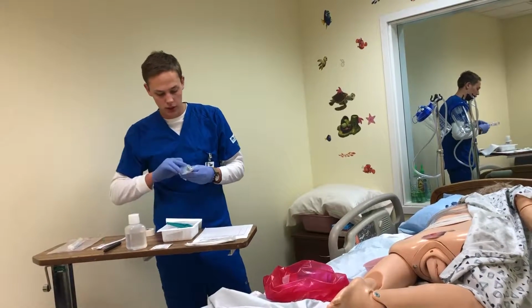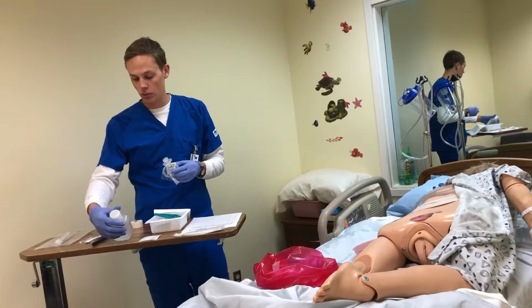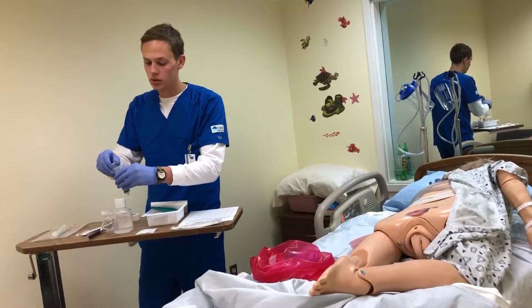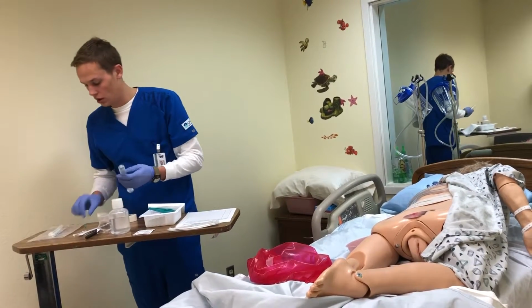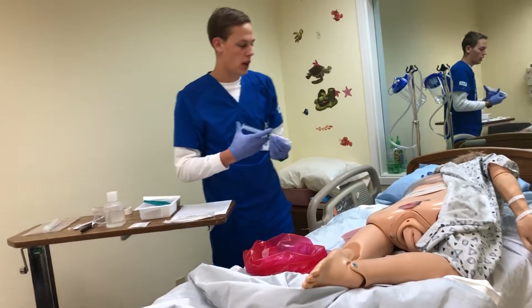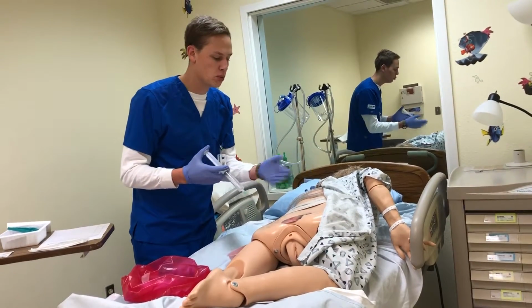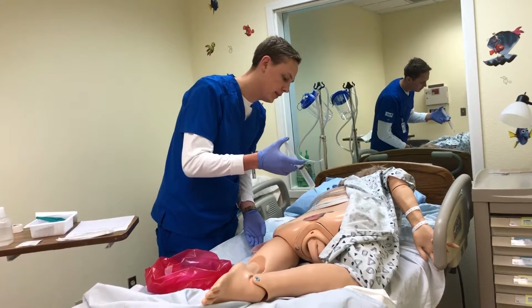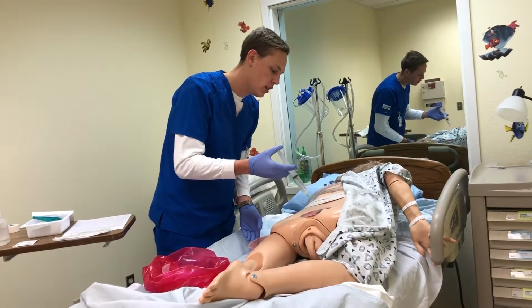So here I just have a regular 30 ml syringe, and here I just have regular 0.9% sodium chloride. So I'm just going to open that, draw up 30 mL, and then screw on an angiocath tip. I'll keep at least 1 to 2 inches away from the patient with the tip of the angiocath, and I'll move from left to right from the very top to the bottom so that it runs down evenly. And I'm just constantly cleaning and not dirtying any other areas.